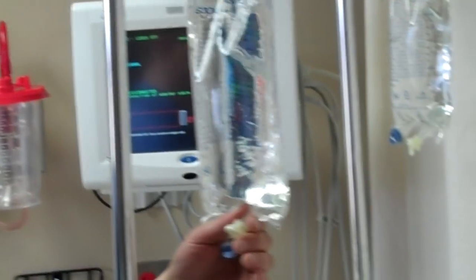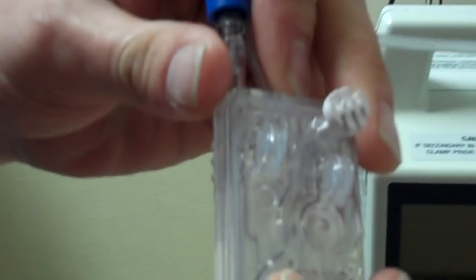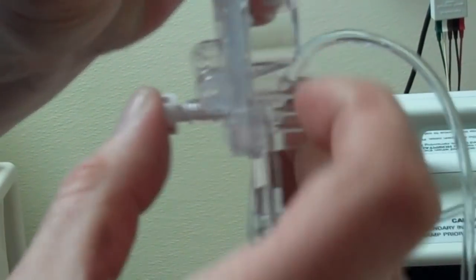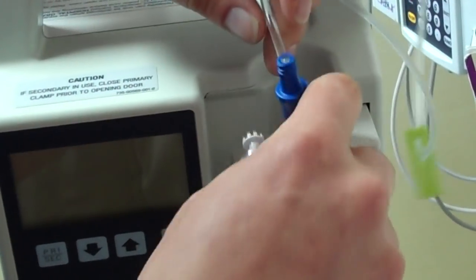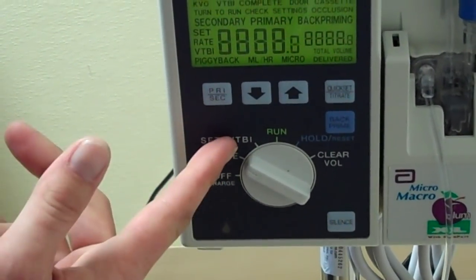We'll turn it off, spike the bag, and we will take the cassette. On the back of the cassette there's a small white knob. This allows free flow to the unit, and we will be turning the cassette upside down, pulling the knob out until this chamber here fills. Then we'll push the knob in, turn the cassette upright, place it into the unit, close the door, turn the unit on, and begin to set our rate, our volume to be infused, etc.